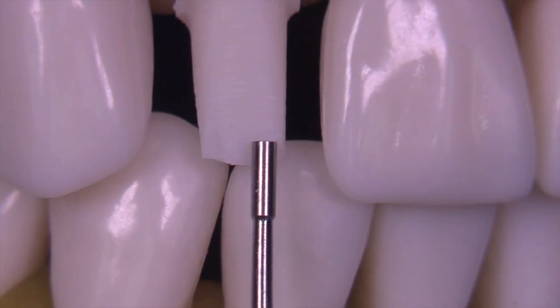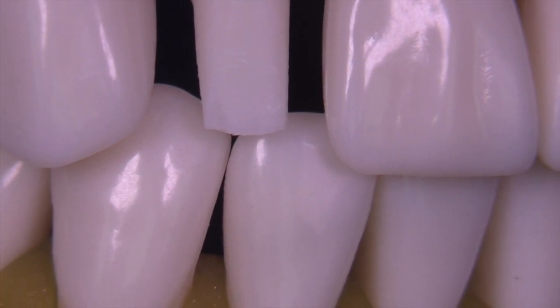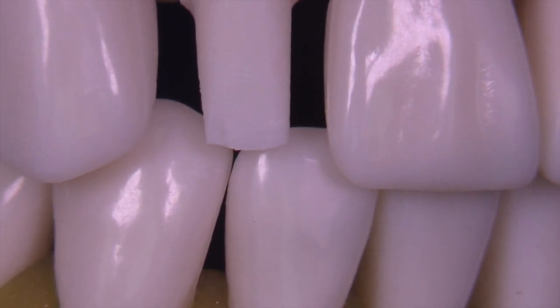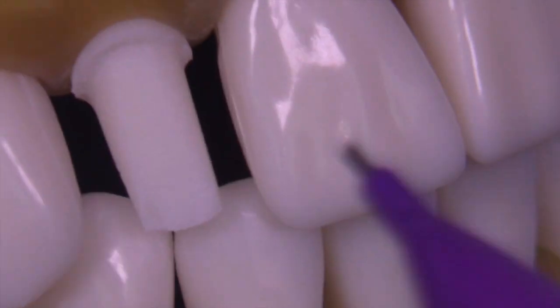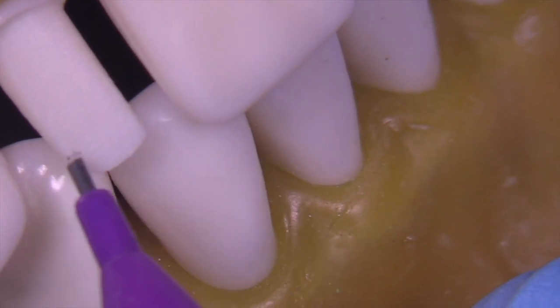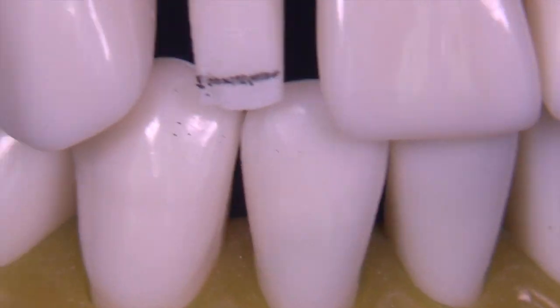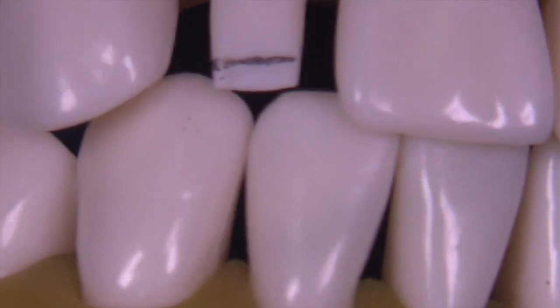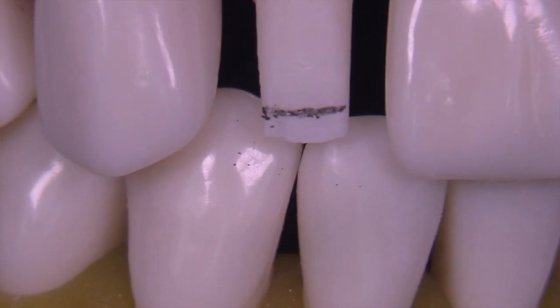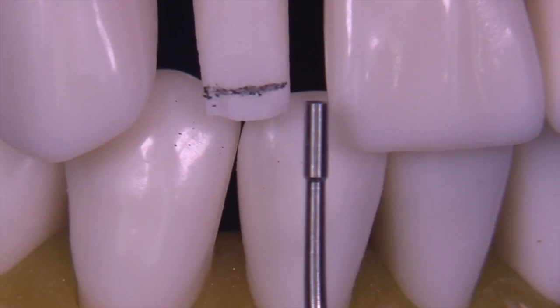Take a look at things and see where you need to make some modifications. You can clearly see the incisal edge is too long — it needs to be reduced so that it's approximately 2.75 to 3 millimeters shorter than the incisal edge of the central. I love getting these determinations before we start the preparation so we have great reference points upon which to gauge the progress.